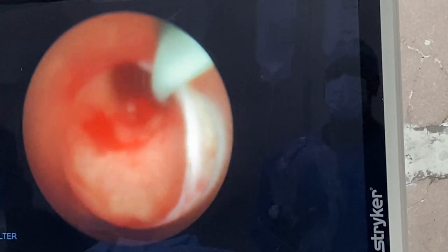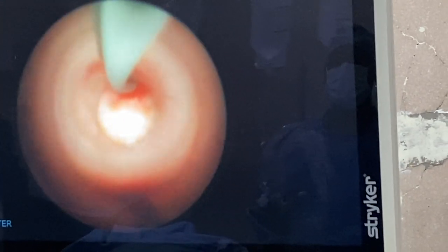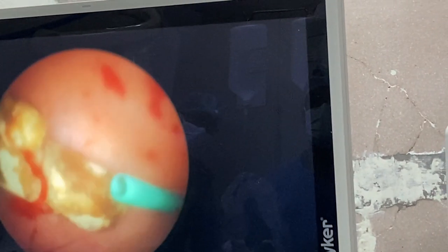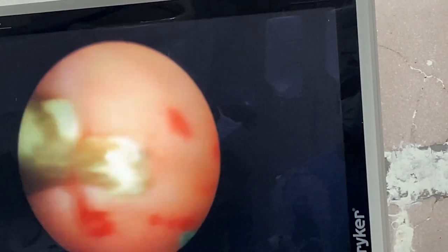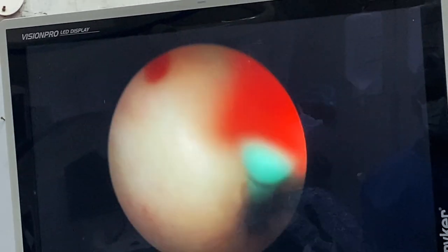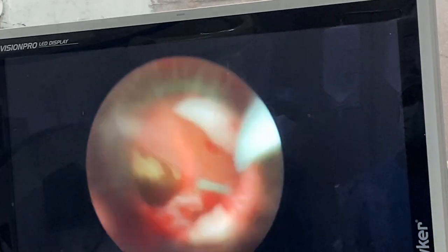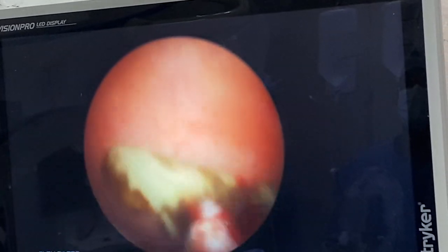Now I am showing the endoscopy view after dilatation. To know whether the puncture is good, you can see the infundibulum in front of you — whenever you see the infundibulum in front, it suggests you have gone through the papilla, so there is no major injury. You can clearly see the stone in the pelvis and the ureteric catheter. Posterior calyceal puncture always gives straight access like this, putting you in a comfortable working position.